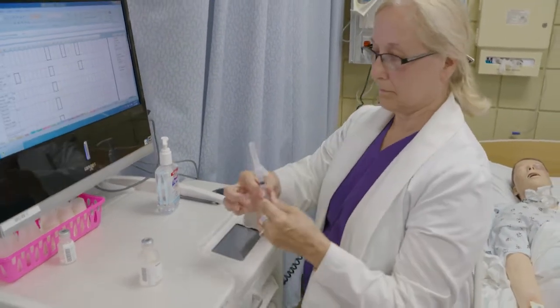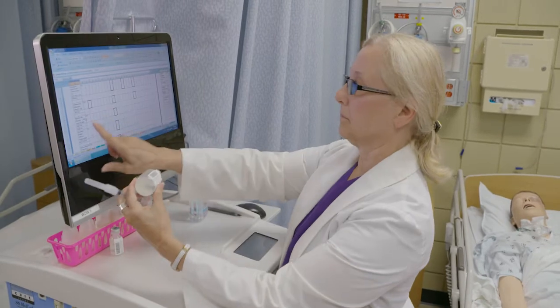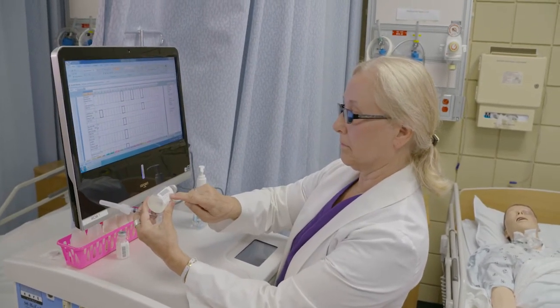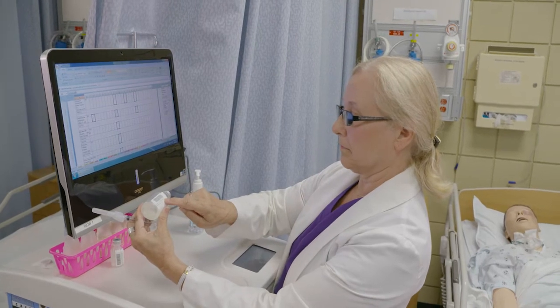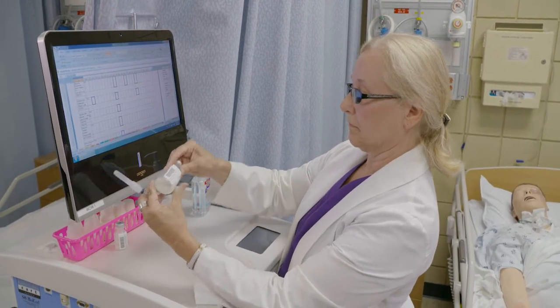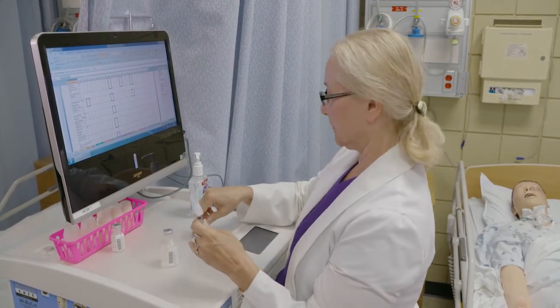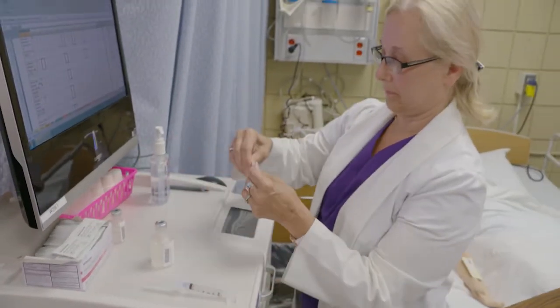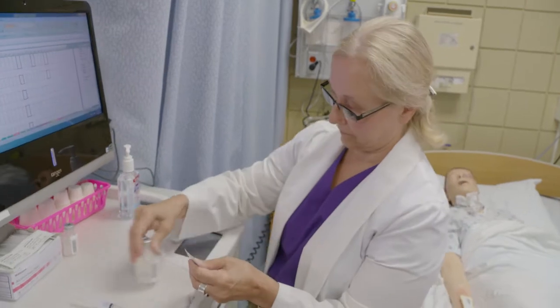Figure out your math dosage from the doctor's order to what is on the vial bottle. The order is 3,000 units. On hand is 3,000 units per ml. You will need 1 ml of medication. Use an alcohol swab and clean the top of the medication vial.